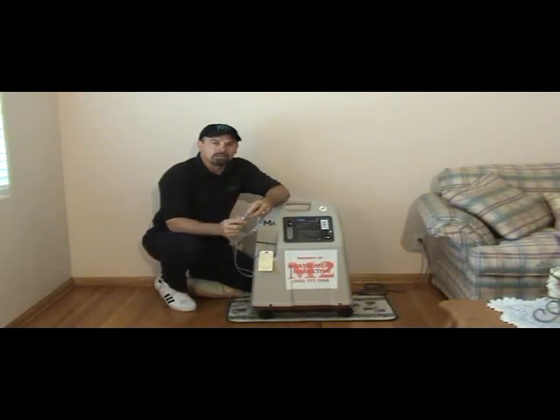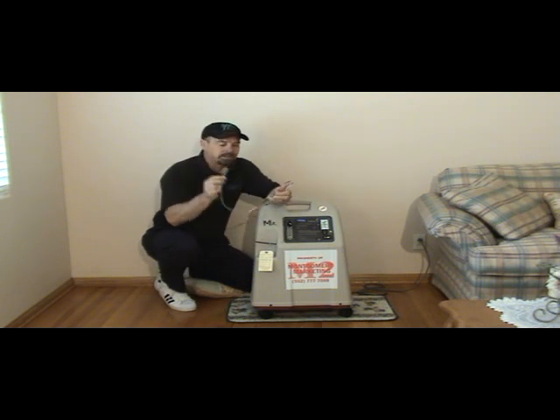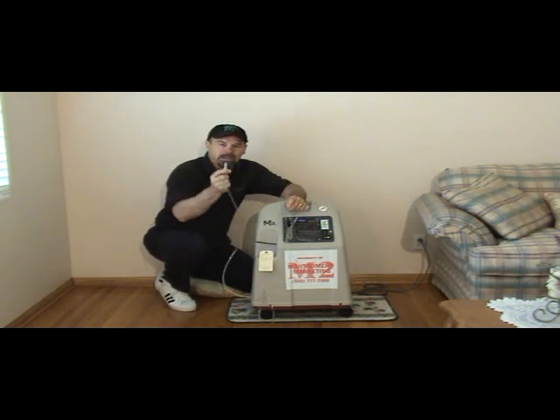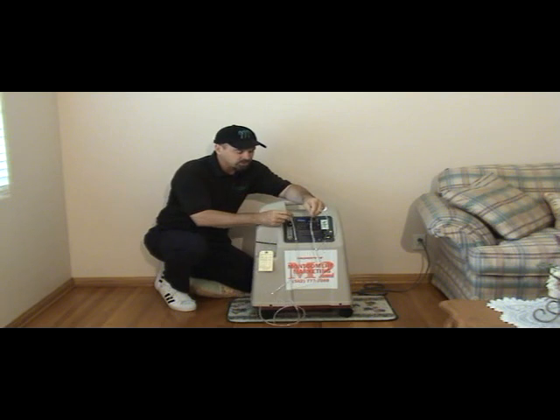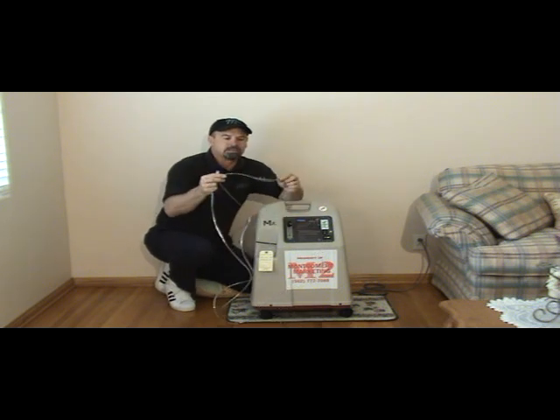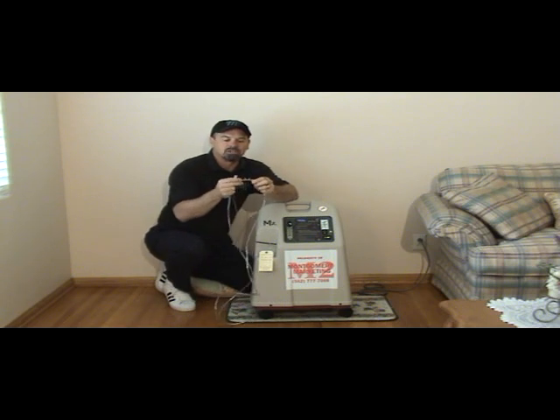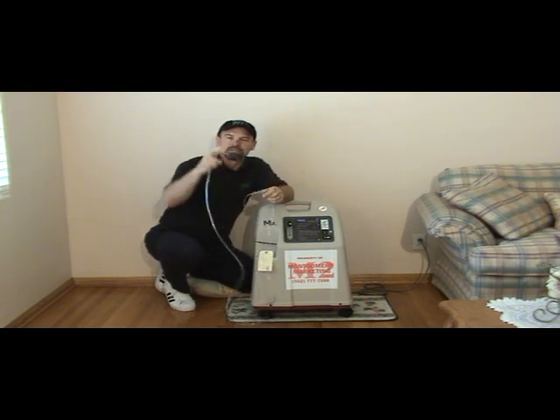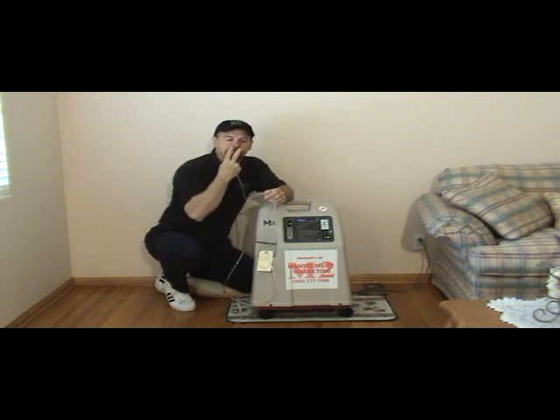Okay, now we're going to go over connections and tubing. The simplest way to provide oxygen to the patient is via a nasal cannula, which is what I'm holding here in my hand. A nasal cannula comes with 7 feet of tubing with it. It has one end that you can see that connects to the nipple on the concentrator, which is the place that we showed you where the oxygen comes out. The other area has 2 extensions, 2 prongs which go into the nose. I know it's hard to see from there, but they curve either up or down. They should curve down into the nose, like this, not up into the nose.